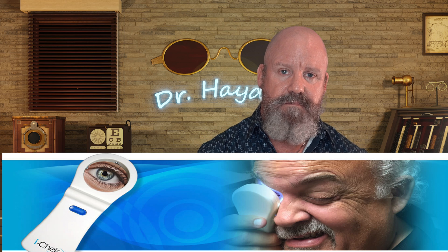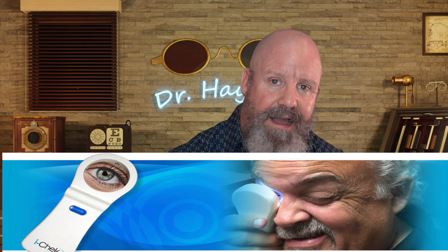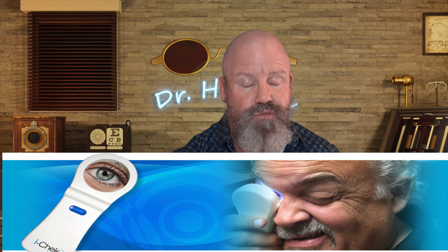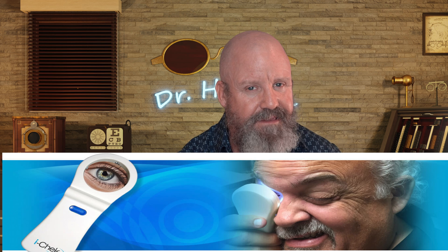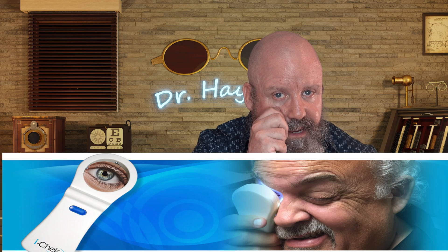The product is called the Eye Check. It's a newer device — you press on the band in the middle and hold it right up to your eye. It's an illuminated mirror that allows you to see your whole eye, tell that the contact lens is there and in place, and you can probably even see the lens moving on your eye. It's really good if you think you were taking the contact lens out and couldn't get it out and aren't sure if it's there. You hold the device right up to your eye, push the button, and you can see your own eye really magnified. It's actually kind of cool, and I'd suggest that if you're a new contact lens wearer, get your hands on one of these. It just takes a couple of batteries, which come included.